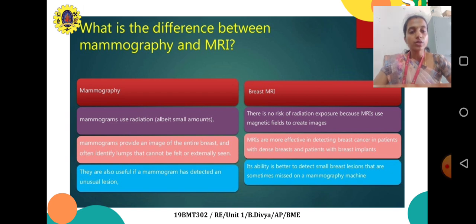In this video, we are going to see the continuation of the previous videos, which explained in detail the mammogram, the types of mammogram, how the mammographic procedure takes place, what the limitations of the mammogram are, what the patient should and should not do and should follow, what procedures are to be undergone in the mammogram, and the difference between the mammogram and the ultrasound.